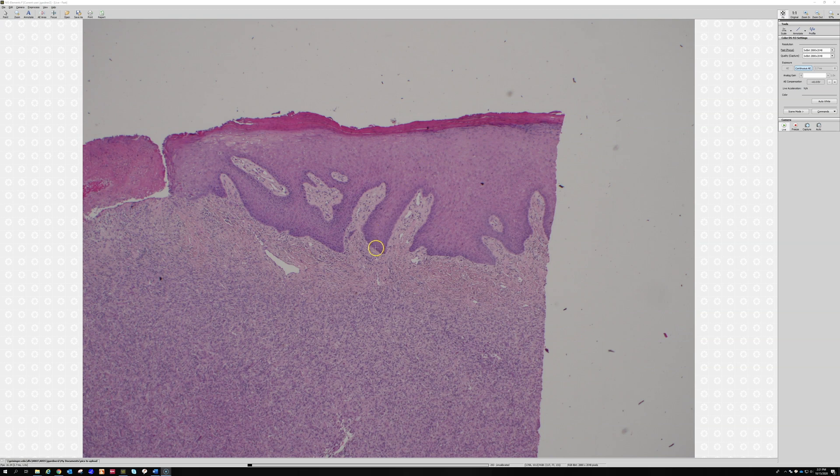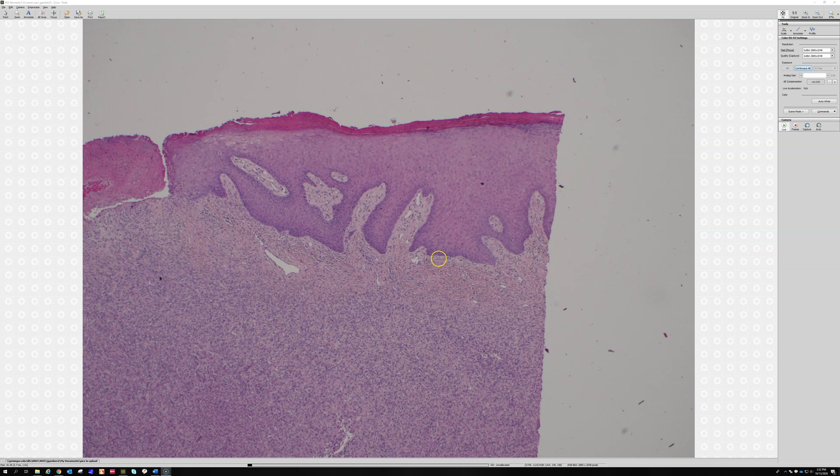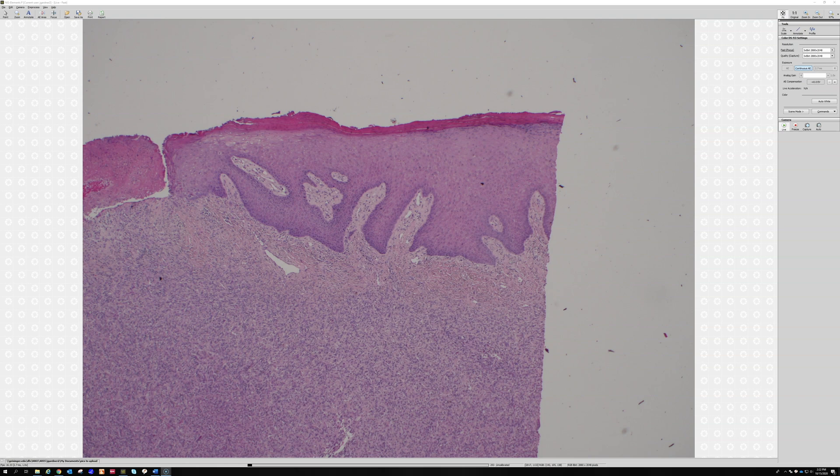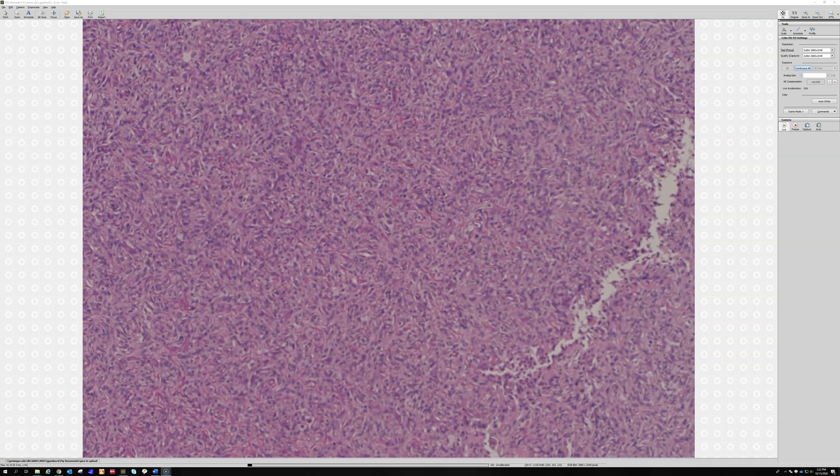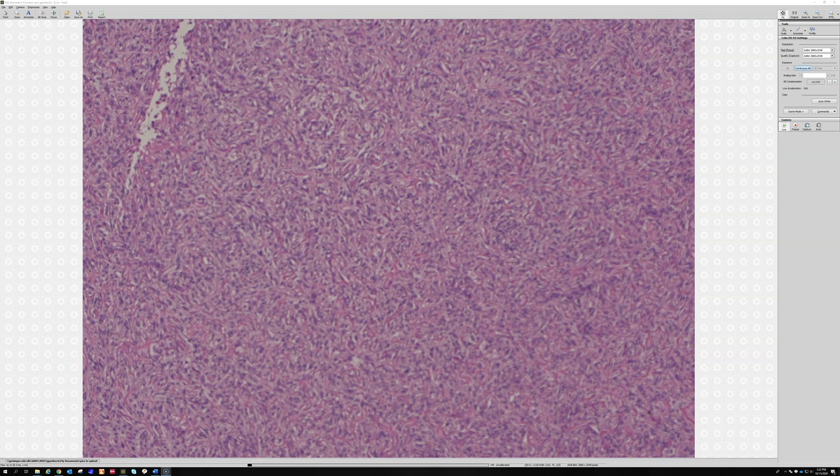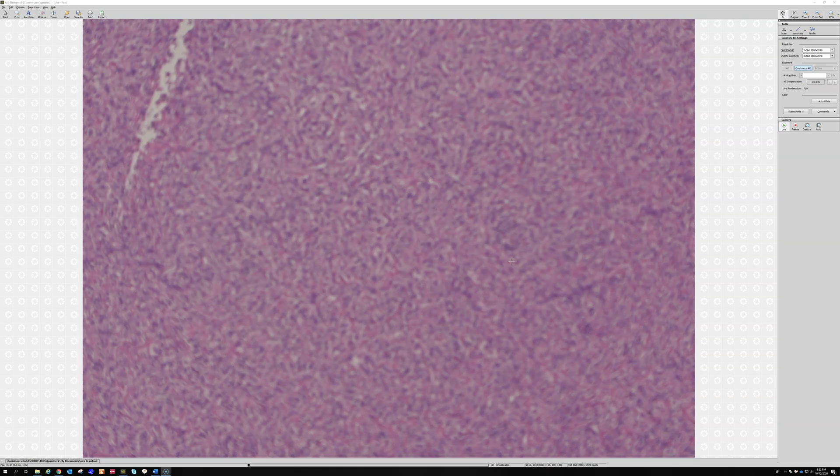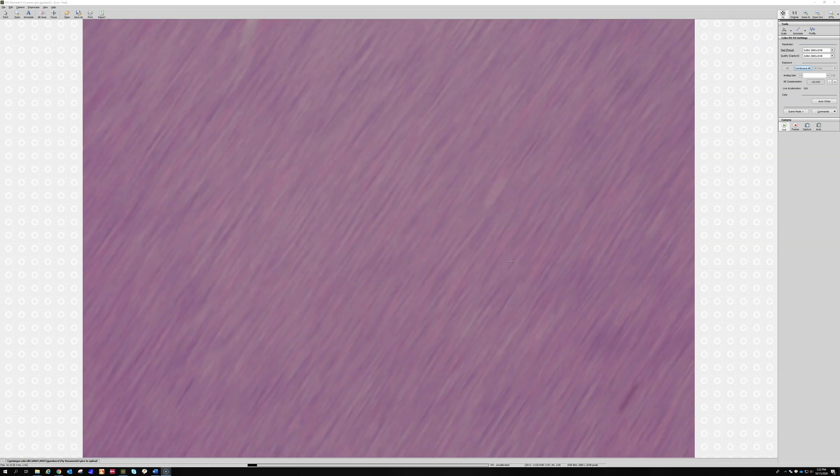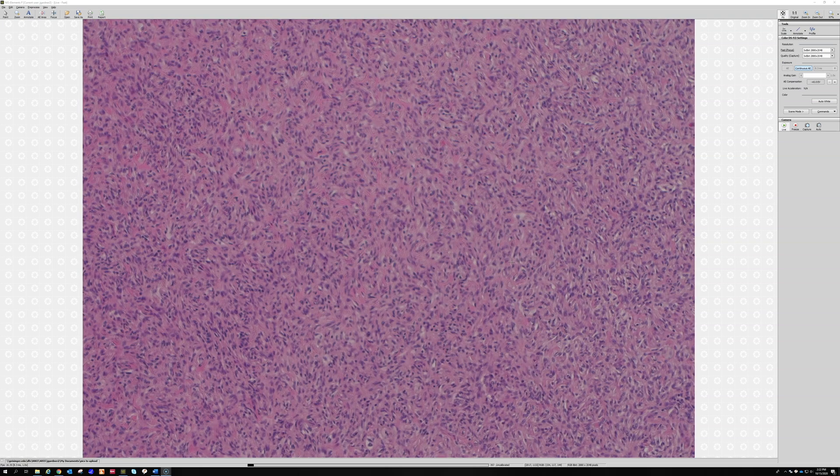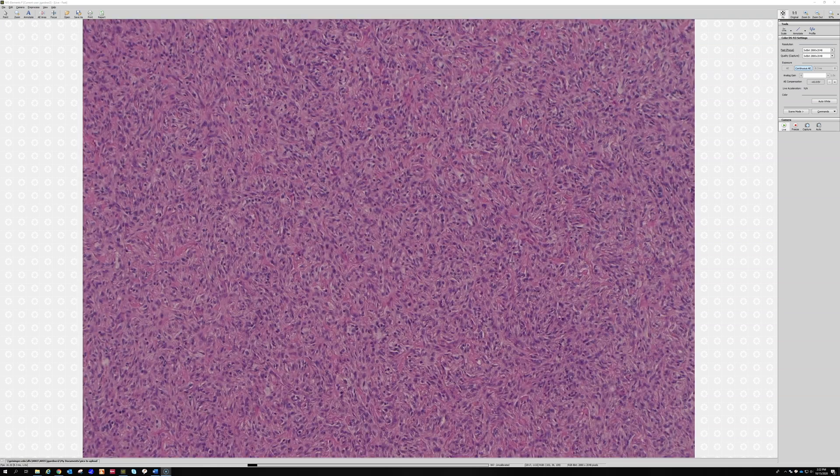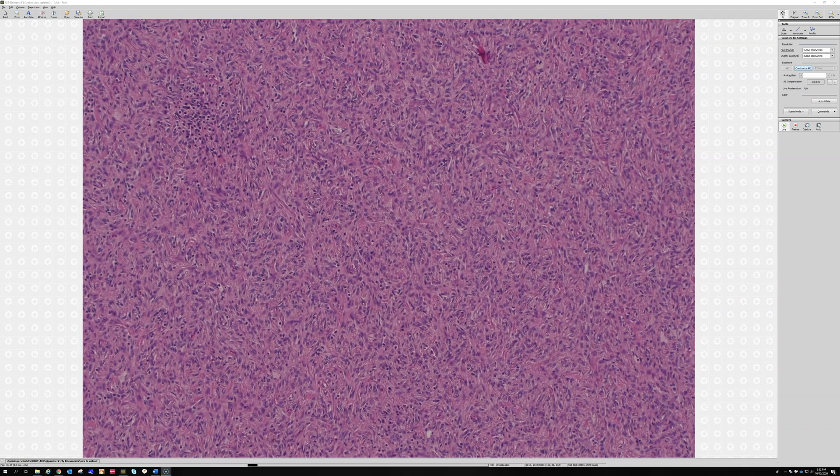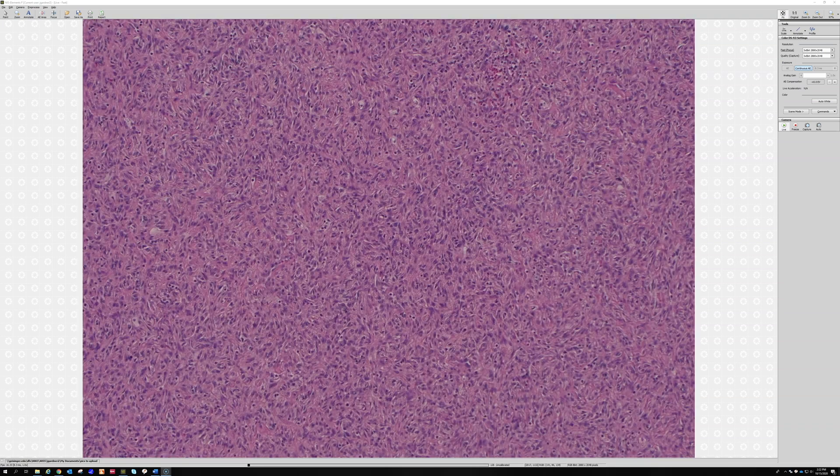See the rete come down, and instead of being pointed, this one comes down and then it's like smashed. It's like a force field of tumor that blocks it and makes it squish flat on the bottom. I find that pretty helpful. Usually dermatofibromas have those. I didn't see any blood-filled spaces or hemosiderin.